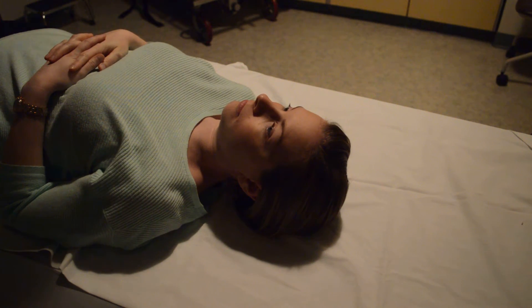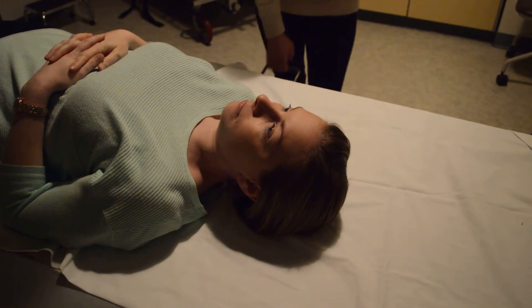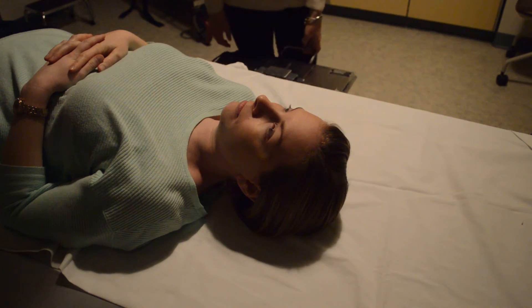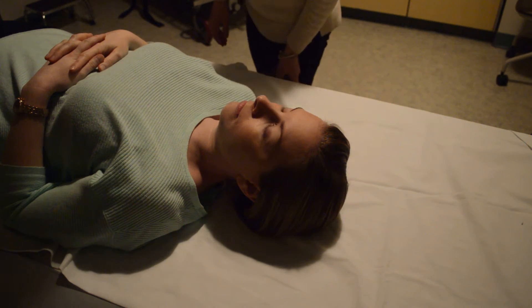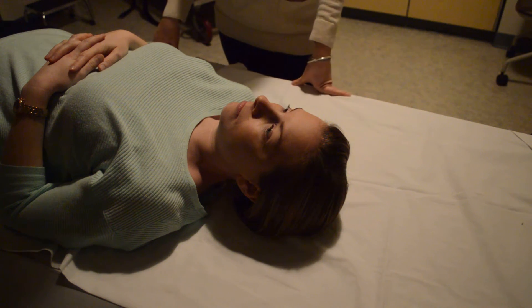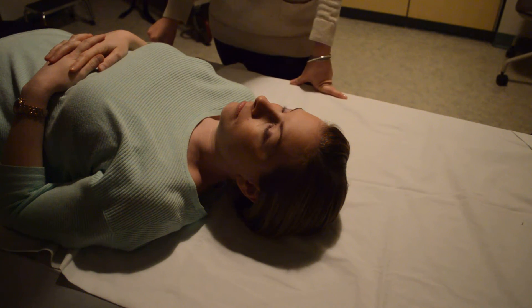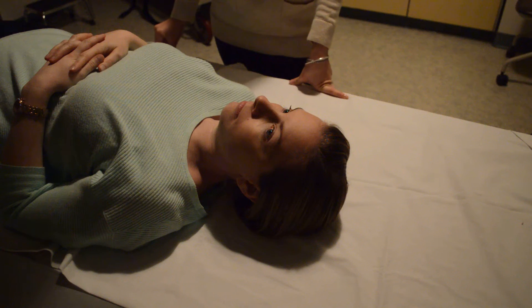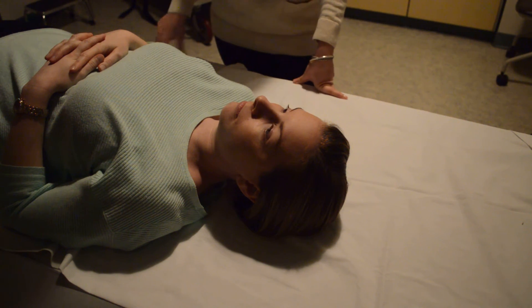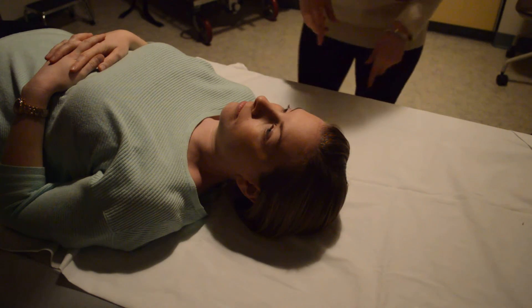We are going to do the AP Axial Towne, 10x12 cassette portrait. Now, if I can utilize my patient's OML, I want to make their OML perpendicular to the IR. Specifically, I'm looking at the orbitomeatal line — the line from the outer canthus through the EAM.